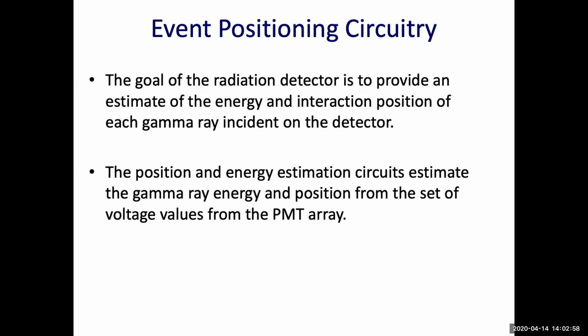So we define the energy of the incident photon. By defining the energy, we can define our primary photon and eliminate the scattered photons. We also need to define the position where the incident photon came from in the patient, to represent the information or distribution of the patient in the image.